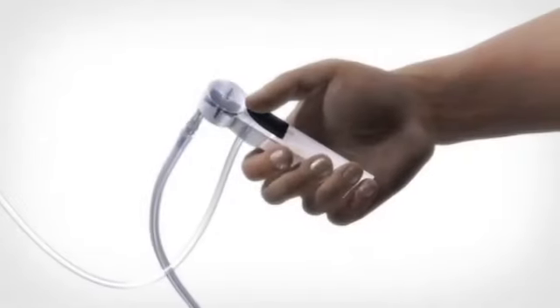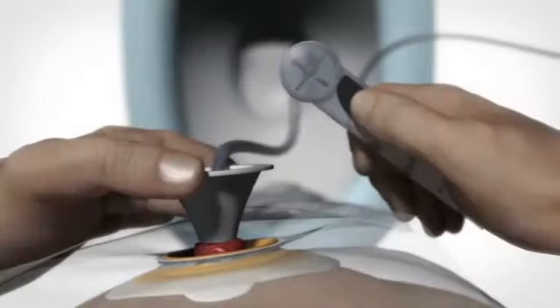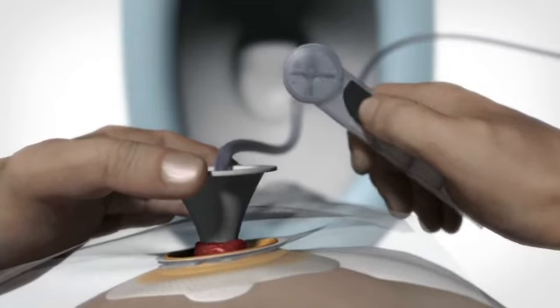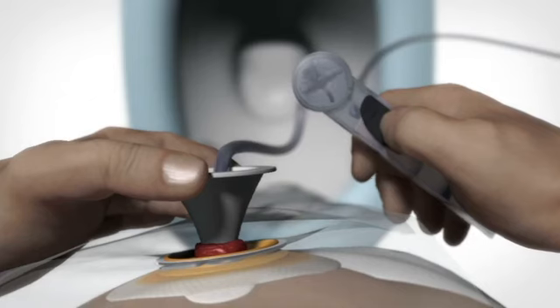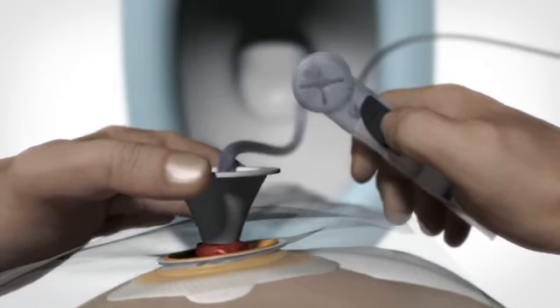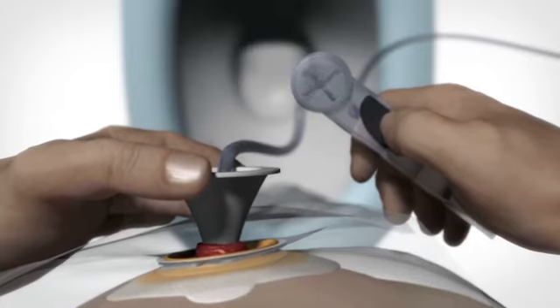Open the flow regulator slowly. The flow of water can be regulated by adjusting the speed on the flow regulator, or by gently adjusting the position of the cone in the stoma. Let the prescribed amount of water in over approximately 10 minutes. Then stop the water flow.